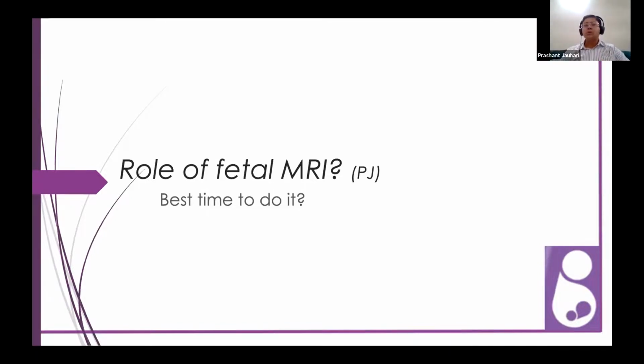They are robust also, that have seen that there could be a possibility of 7 to 15% of detecting an abnormality on a fetal MRI over and above your neurosonogram and even an extended neurosonogram. And we should take this key.